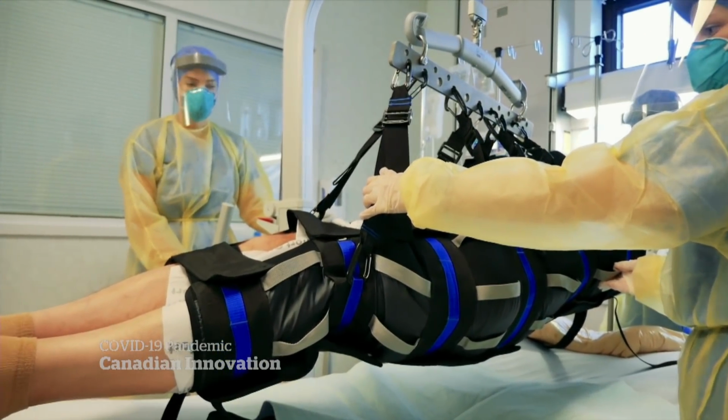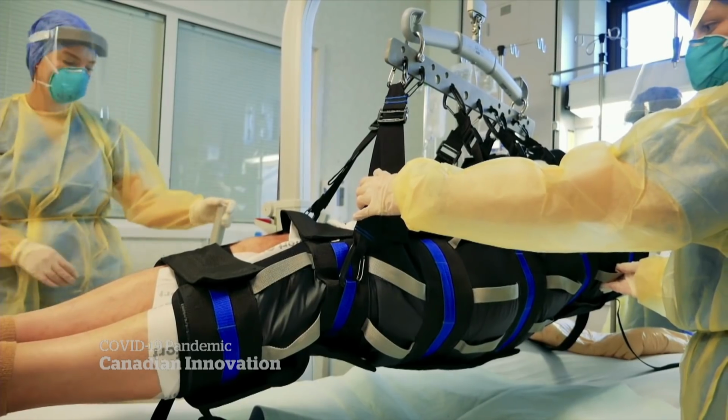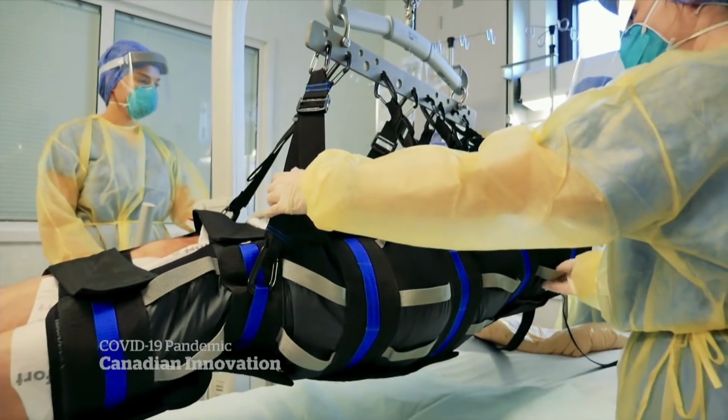Dr. Bede has a patent on his invention, a one-of-a-kind, he believes, and the device is now in clinical trials at Halifax's QE2 hospital, where you couldn't fault occupational health and safety lead Angela Keenan if she cringed every time a nurse lifted a patient. It's the driver of our not only injury rates within the organization, but actually it's the number one driver for our time loss claims as well for the organization.